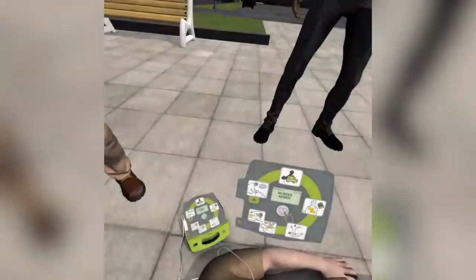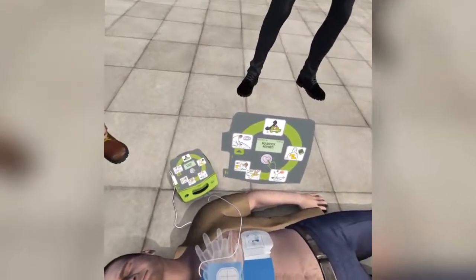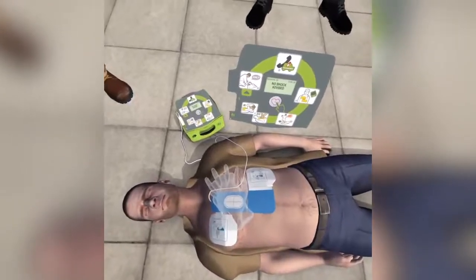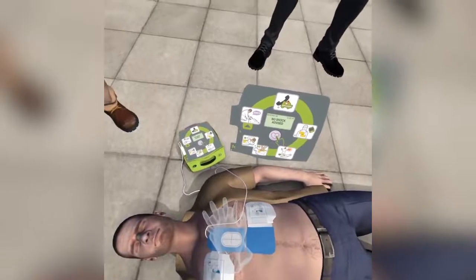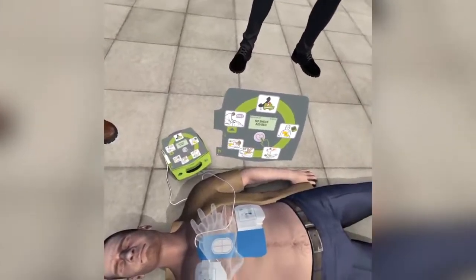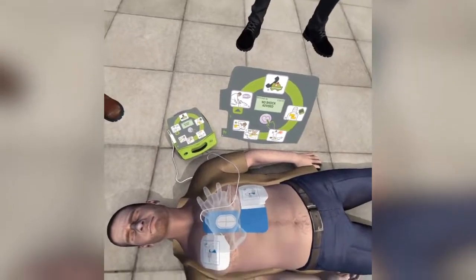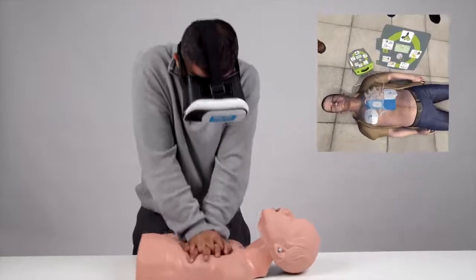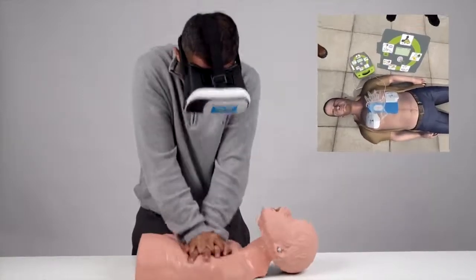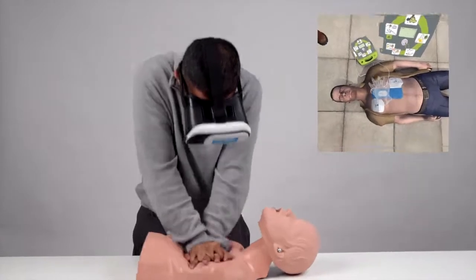Place your hands on whatever you're going to be simulating compressions on. This could be a mannequin, table, or back of a chair. Place your left hand over your right hand and interlock fingers. Keep your arms straight. When the app indicates that you should begin CPR compressions, ensure that your head is above and moving up and down with your compressions. Watch the screen. Note that the app measures compressions by the movement of your head and phone, not your hands. Continue doing compressions as instructed. The app does an abbreviated CPR cycle of about 1 minute.